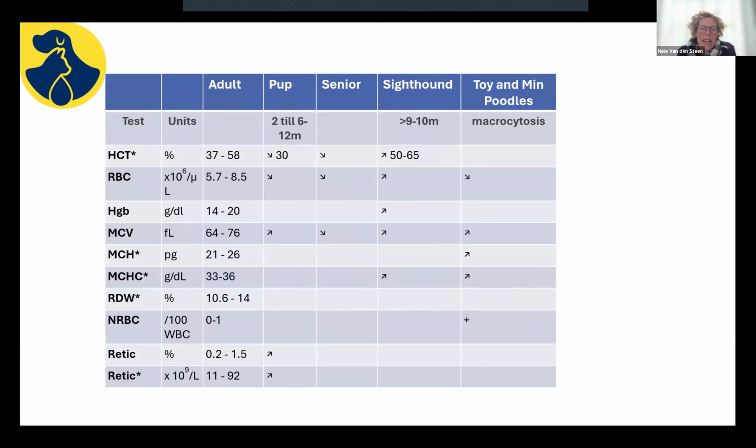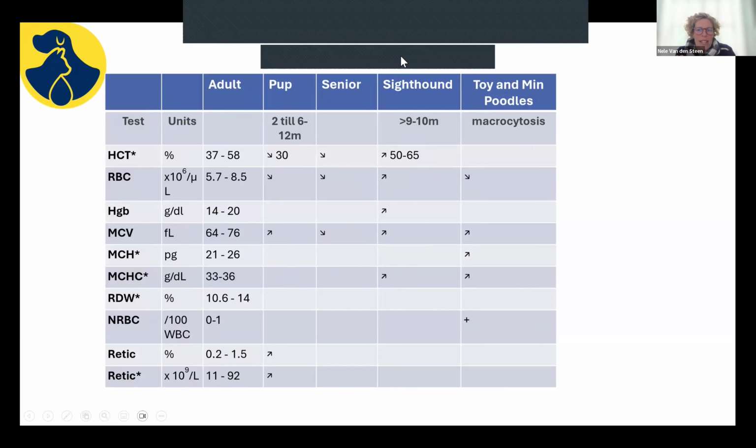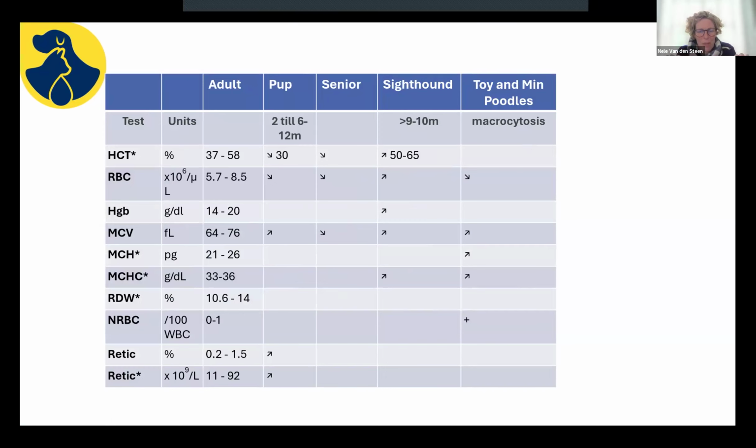So when we then look at physiological variations, I've put a few things on here. So we said with normal dogs, that's a general baseline that will come on your reference ranges. They're normal adult dogs. Average breed is what you get. As with any reference range, about 5% of the patients will fall out of that normal reference range and will still be their normal. So take that into consideration, but often they're not very far outliers. But some dogs might have slightly different values. And these reference ranges vary from analyzer to analyzer. So things there to consider.